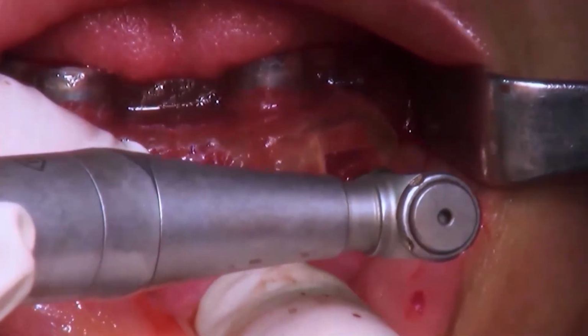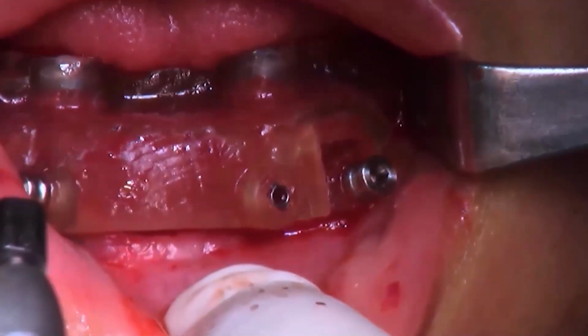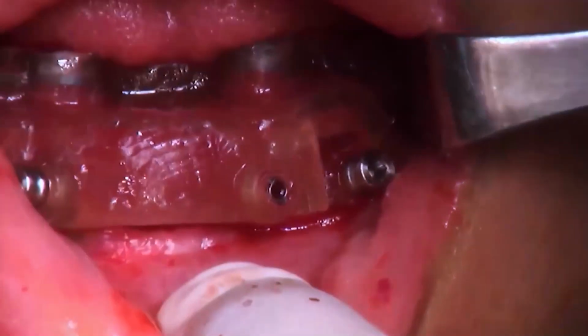After placing the implant, anchor screws are removed.